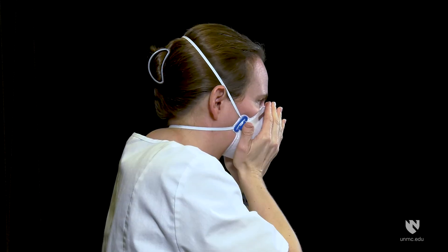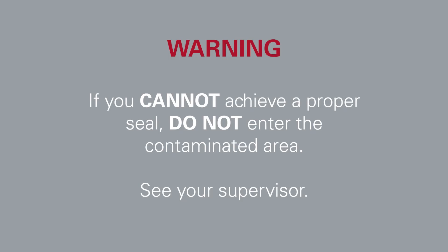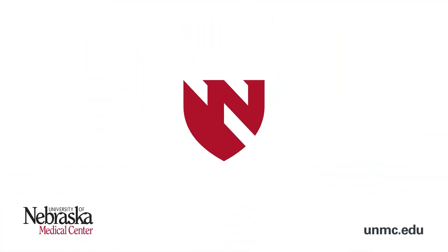Seal check by blowing air through the mask. If air leaks out around the nose clip or elsewhere, readjust the nose clip, strap tension and mask position. Repeat seal check process.